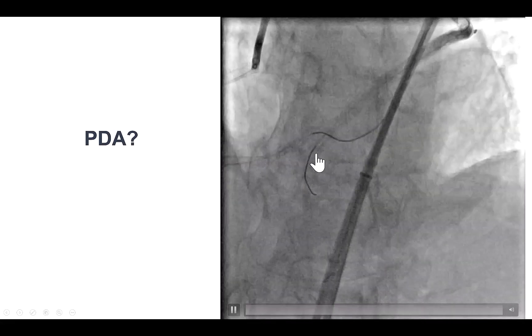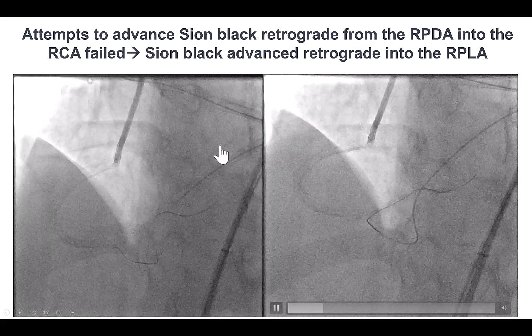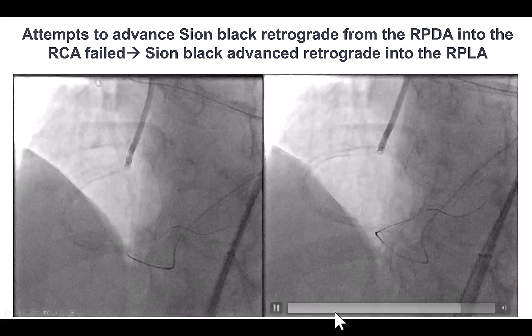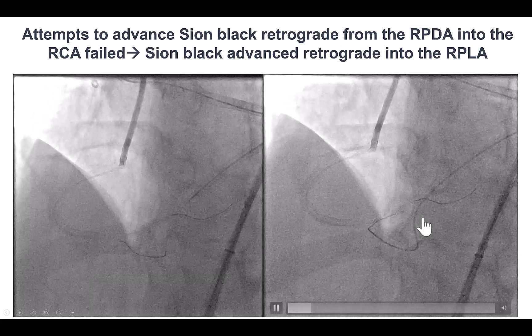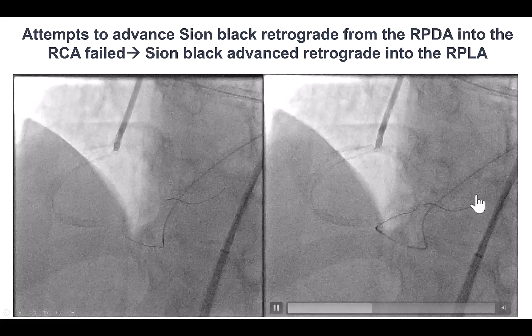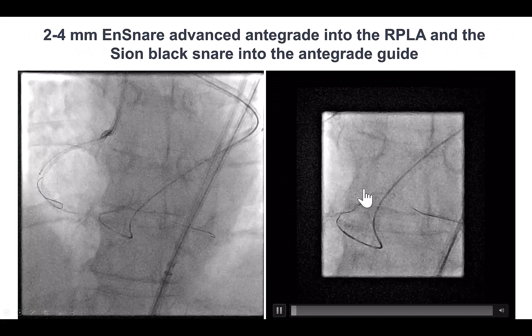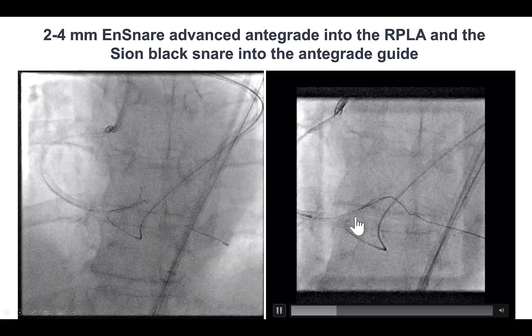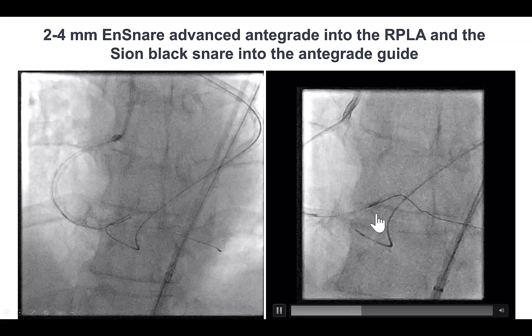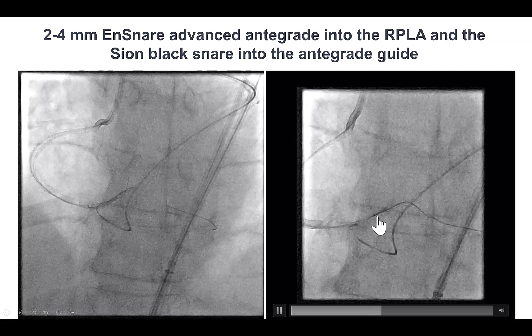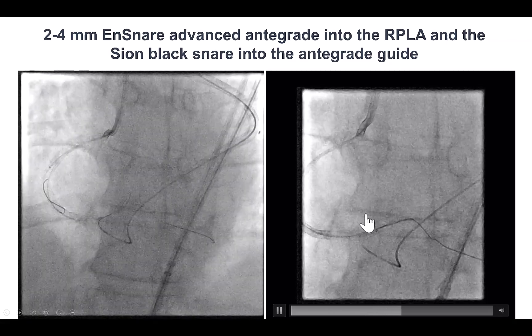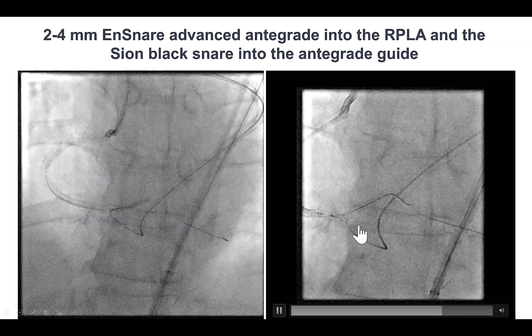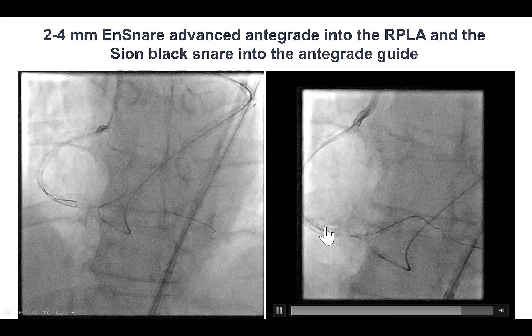Regarding the posterior descending artery — we wanted to dilate it, but had a similar issue and could not advance an antegrade wire into the PDA. We advanced a retrograde guide wire, but it went into the posterolateral instead of going retrograde into the RCA. After multiple attempts, we used a trick: we advanced a micro snare antegrade into the posterolateral, advanced the retrograde guide wire through the micro snare, then pulled the micro snare back. By doing that, we were able to pull the retrograde guide wire back into the distal right coronary artery. This is an example where using a snare can help advance a wire retrogradely into the distal RCA.